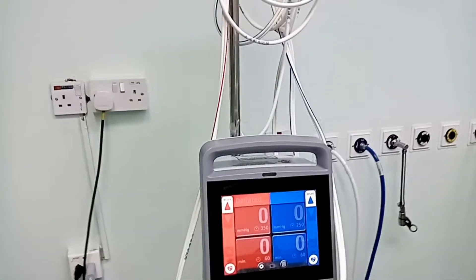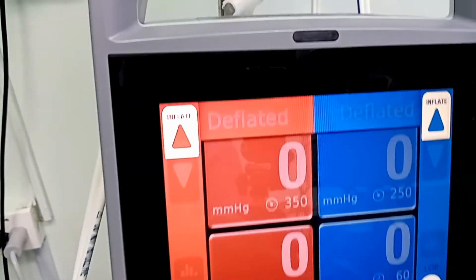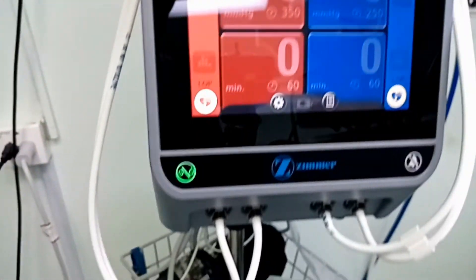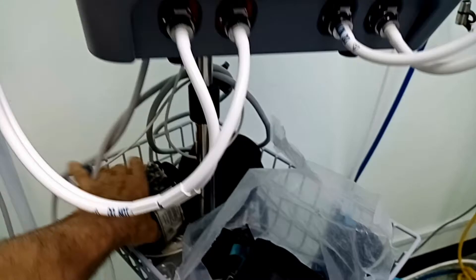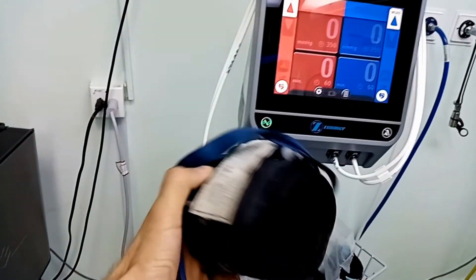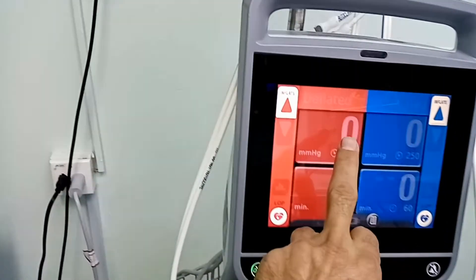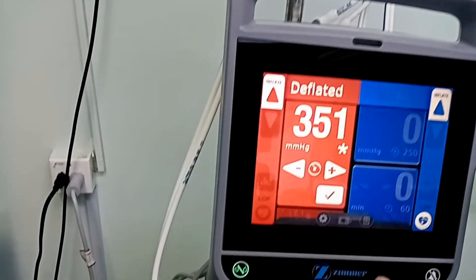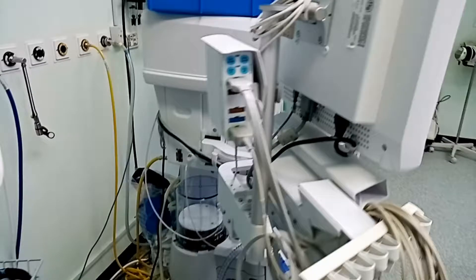جهاز التورنيكيه بيستخدم في عمليات جراحة العظام. هو بيعمل عملية ضغط على المعصم أو الرجل. بيتكون من جزئين، لونه أحمر وأزرق، ومعه مجموعة من الكفات. بيبتدي التحكم فيه من درجة 250، وبيمنع انتقال الدم من مكان لمكان. بيعمل عملية حزق قوية أثناء العملية الجراحية عن طريق النفخ والضغط على الشرايين.